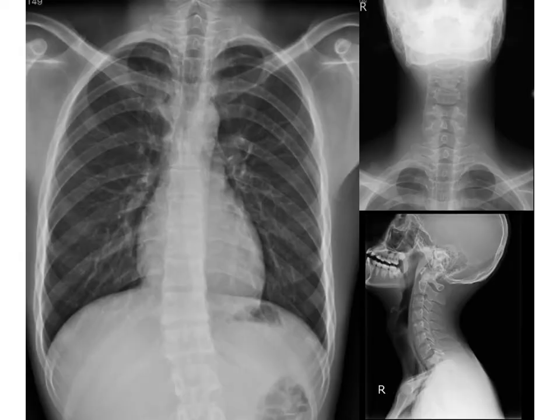So, is that so obvious? No. Difficult to find, right? Here, pneumomediastinum, and here, difficult to find compared to the ultrasound finding, because we use linear one, we amplified the finding, make it easier to see the superficial part.